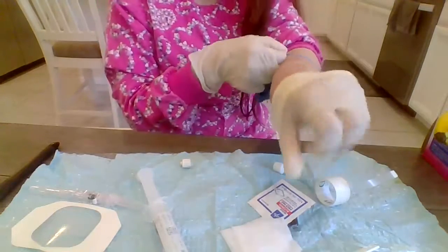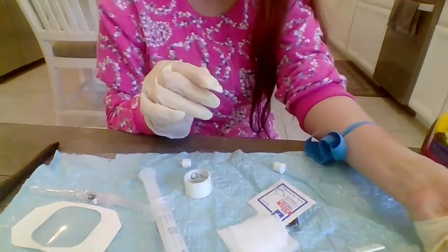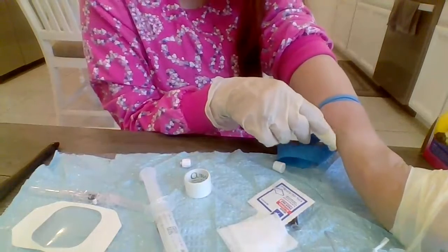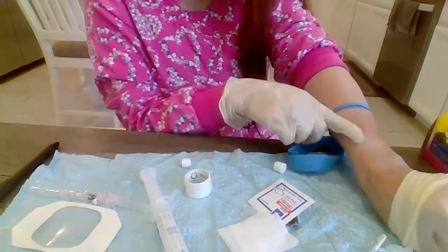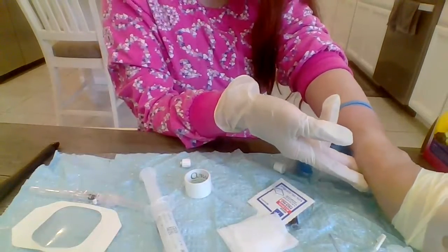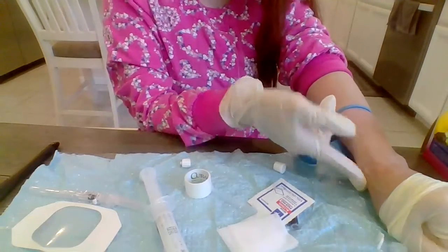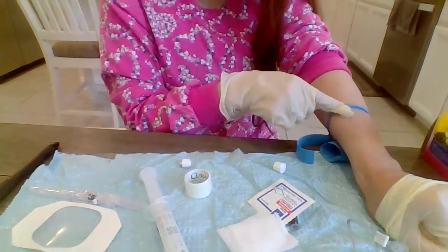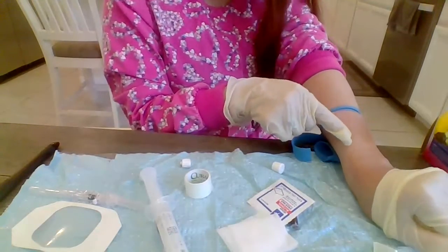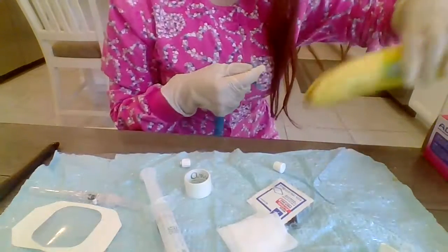Just lightly. And then I'm going to ask the patient to pump the fist. So now you see the vein is already popping out, and I'm going to go ahead and check the pulse and make sure that I'm not preventing too much blood flow. Okay, so it's still sufficient, so that's good. So this is where I'd be doing the IV site. Now the actual procedure will be on the banana.